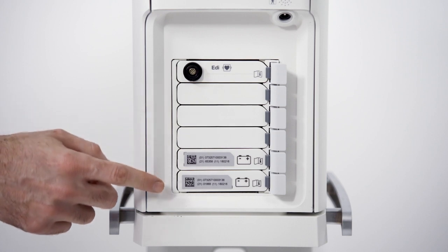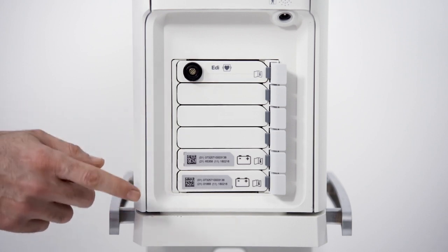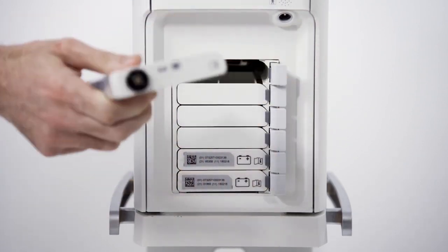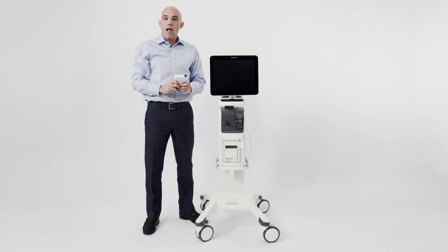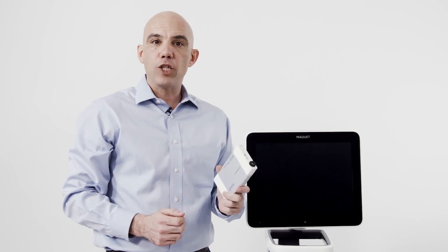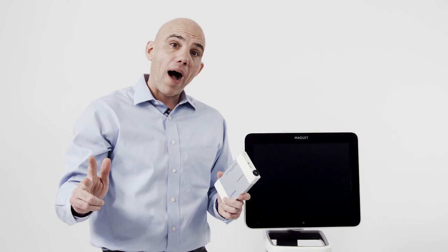The Servo-U ventilator utilizes a unique module system. There are six slots on the device for batteries or clinical modules. Modules can be inserted or taken out of the device at any time. Available modules include EDI for NAVA capabilities, neonatal Y sensor, and end-tidal CO2. Modules are interchangeable between the Servo-U, the Servo-N, and the Servo-I devices.